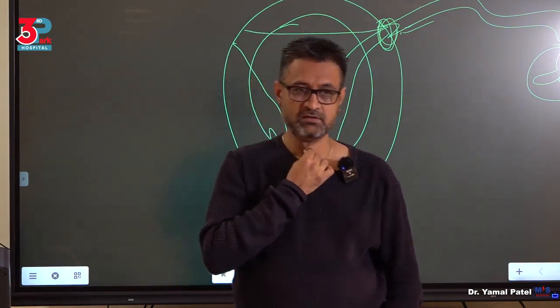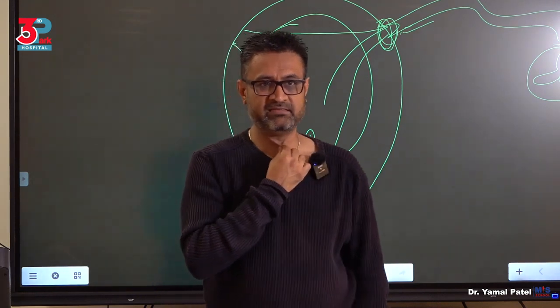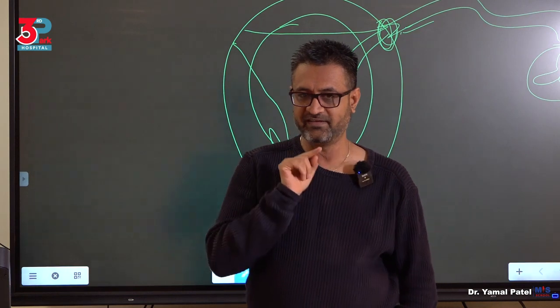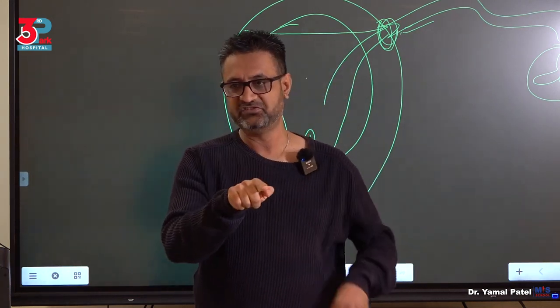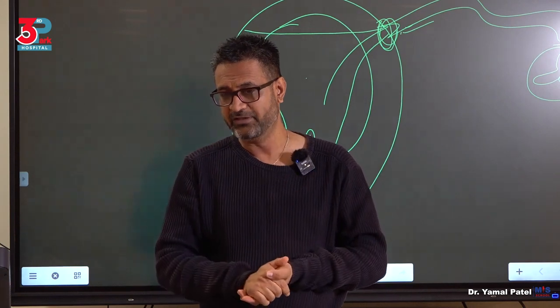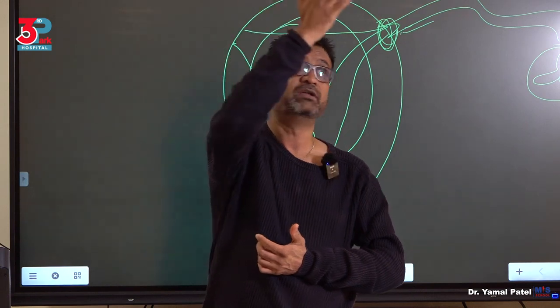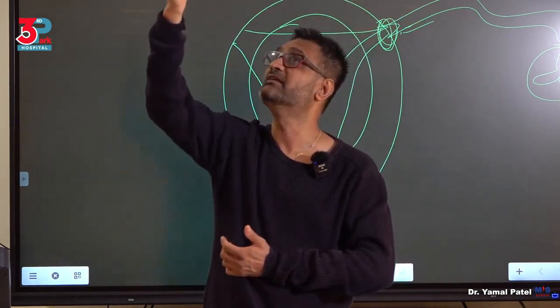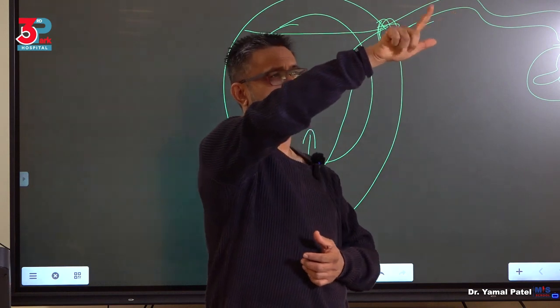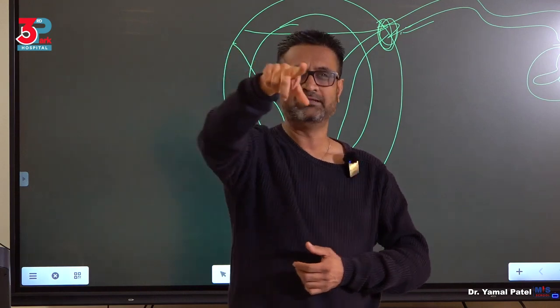Vaginoscopic approach. My team knows exactly what I mean by that, and they do it all the time. Vaginoscopic approach means you first enter the vagina and distend the fluid. When you distend the fluid, you will see the vaginal wall. So you can also do vaginoscopy and say, okay, this wall is fine. This is the rugae. What is this small nodule here? Why is there this vaginal polyp? You get what I'm saying?